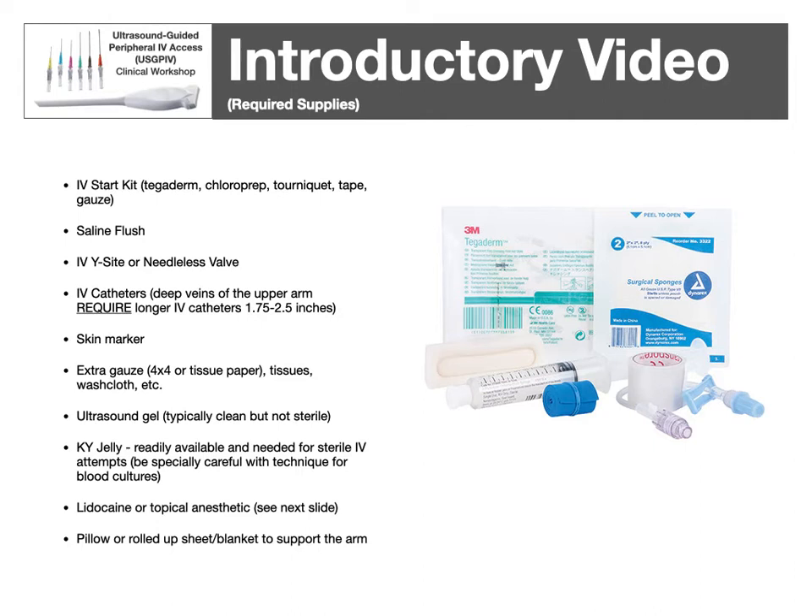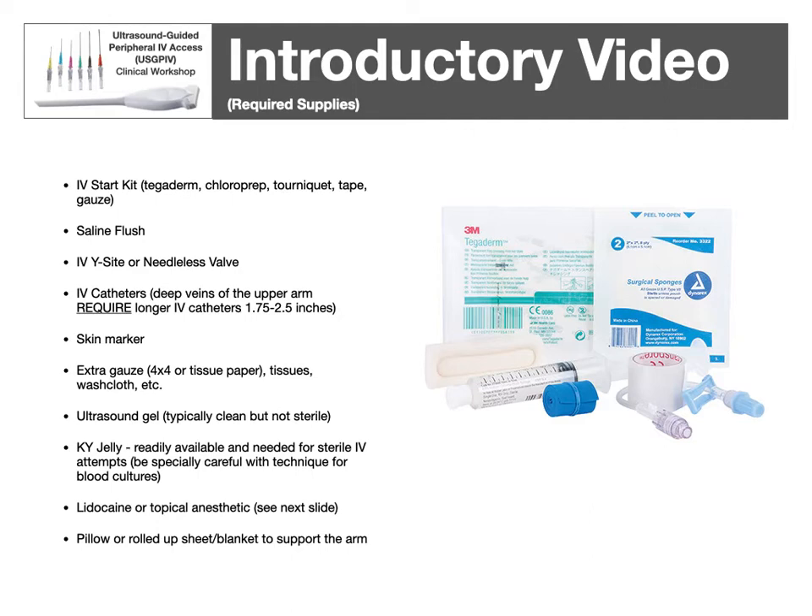For supplies, you'll need an IV start kit with a Tegaderm, Chloroprep, tourniquet tape, and gauze. You'll need a saline flush, IV Y-site or needleless valve, and IV catheters — these need to be longer than your traditional IV catheter. I recommend a skin marker to mark your site, and extra gauze to wipe off ultrasound gel, such as a tub of gauze, tissue paper, or washcloths. Ultrasound gel is typically clean but not sterile — you'll need KY jelly in sterile packs for your actual insertion. Also lidocaine or a topical anesthetic, and a pillow or rolled-up sheet or blanket.